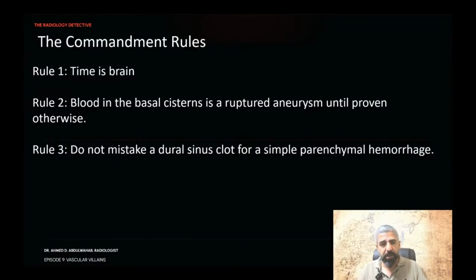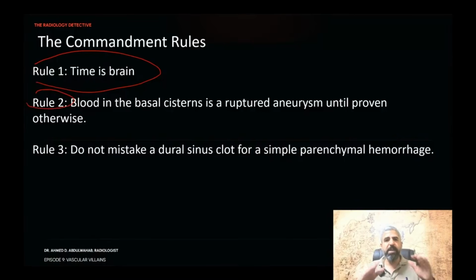Watch the venous channels. Rule number 1, time is brain. Rule number 2, blood in the basal cisterns is a ruptured aneurysm until proven otherwise. And rule number 3, do not mistake a dural sinus clot for a simple parenchymal hemorrhage.